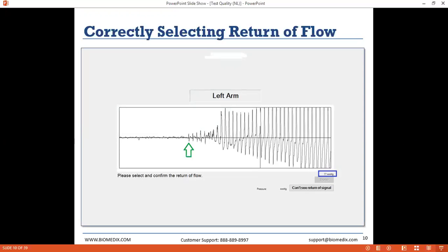On the left-hand side, where the pressure is very, very high, the limb is occluded. There's no blood flow going through that arm or that ankle, and obviously the PPG probe on the finger or the toe isn't going to detect a pulse. Similarly, on the right-hand side, the cuff is very loose. It's not restricting blood flow in any way, and the PPG probe is showing great big pulses from the blood flowing through that location. So just like with the stethoscope method, our interest is more towards the middle. We're looking for the very first time that a pulse manifests itself on this trace.